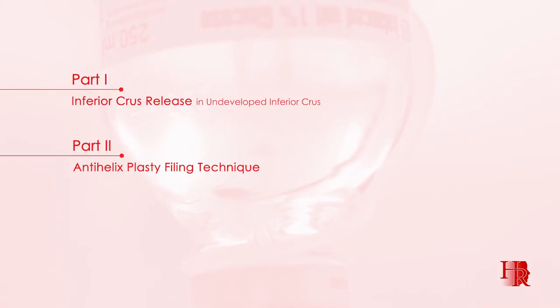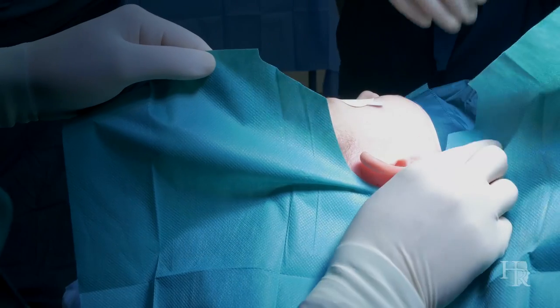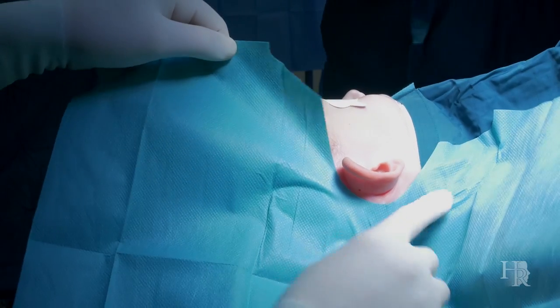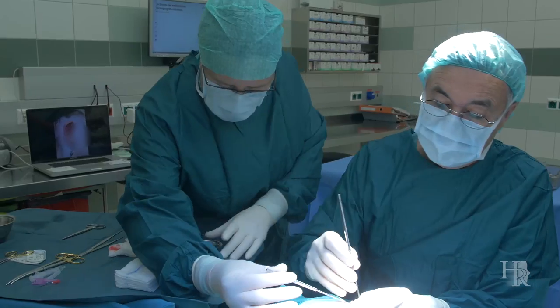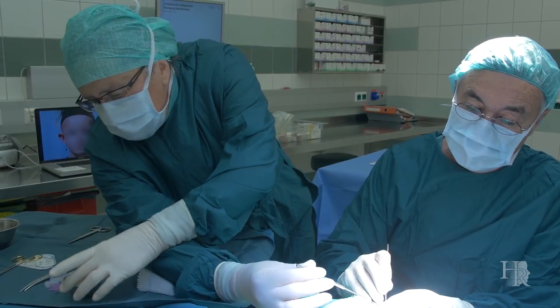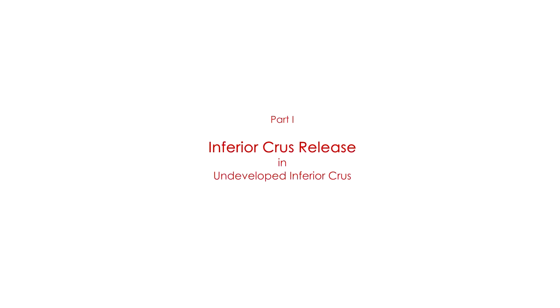Now I will show you in several parts how to access the inferior crus, the antihelix plasty, and the reduction of the conchal cavity. It all starts with a good draping. With the draping you have to remember that you will work on the posterior space, so you keep enough room when you drape it.